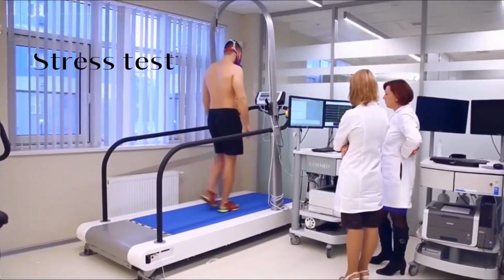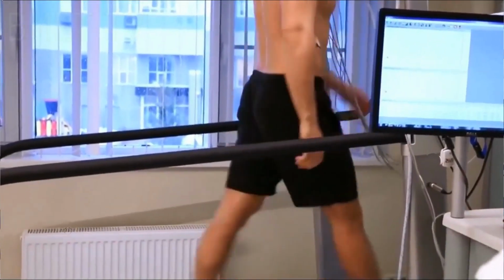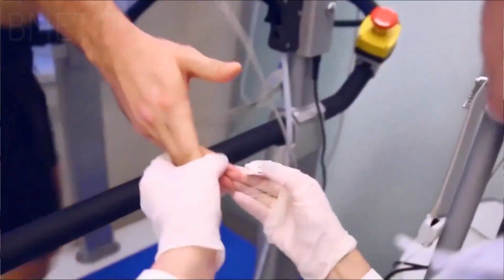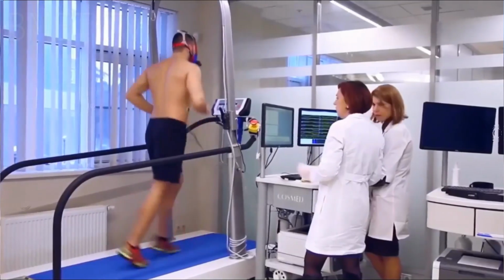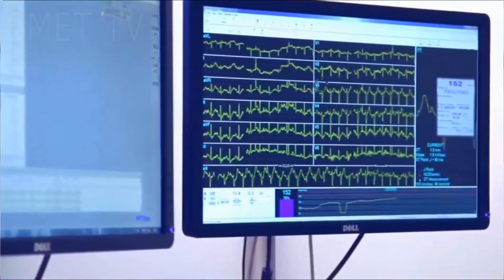The second type of ECG machine is a stress test, also called treadmill test or exercise EKG. This is given while a patient walks on a treadmill or pedals a stationary bicycle to monitor the heart during stress exercise. Breathing and blood pressure rates are also monitored. A stress test may be used to detect coronary artery disease or to determine safe levels of exercise following a heart attack or heart surgery.